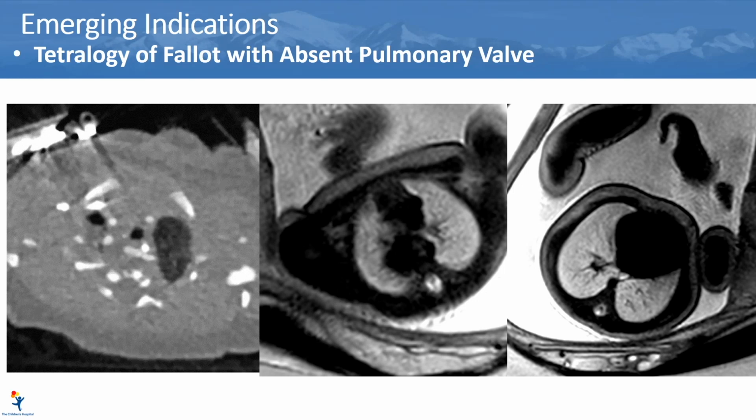So, I think there's an awful lot to offer in this disease with fetal cardiac MRI, and it does seem to help prognostically if you're able to see what's going on prenatally. It does seem to correlate with what happens afterwards.